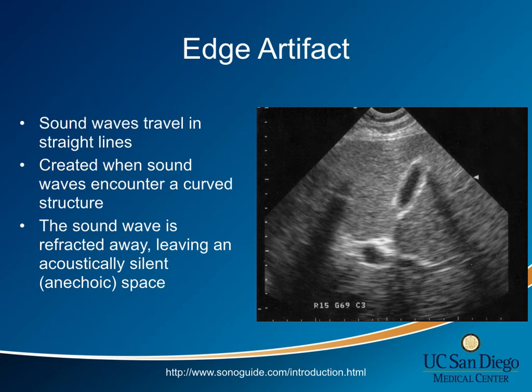Edge artifact will often look like anechoic rays off the edge of a curved structure. Do not be fooled into thinking this is abnormal fluid. Really, it is just a form of refraction.